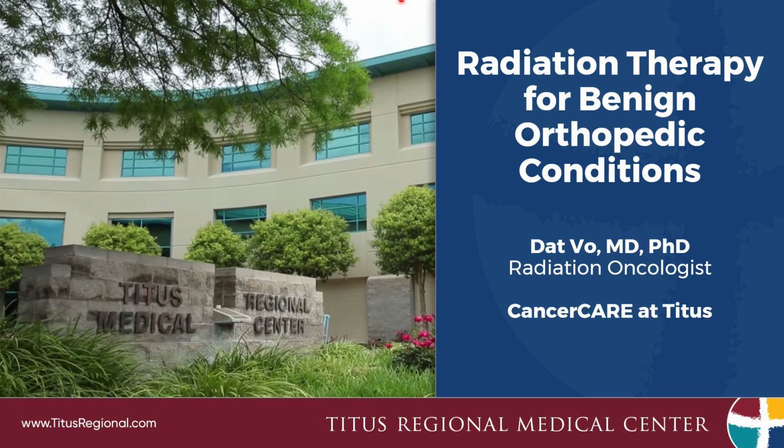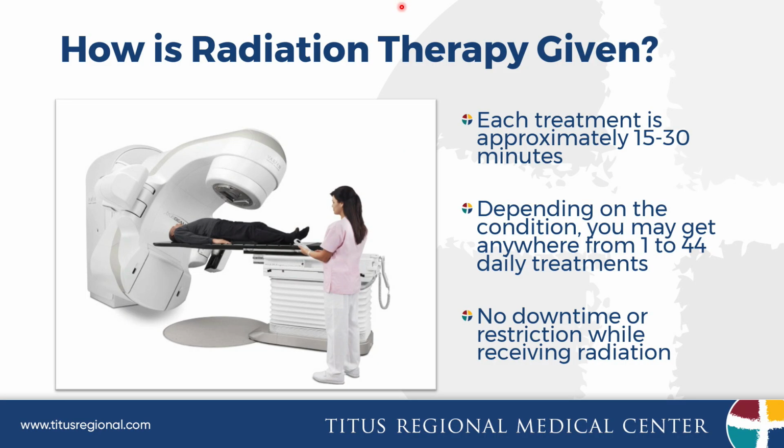Today, I'm going to give a brief talk on the role of radiation therapy for benign orthopedic conditions. Before we start on the role of radiation for benign orthopedic conditions, I would like to talk a little bit about how radiation therapy is given.